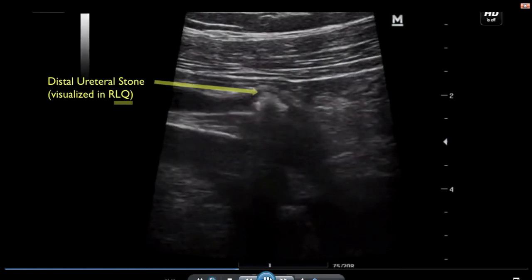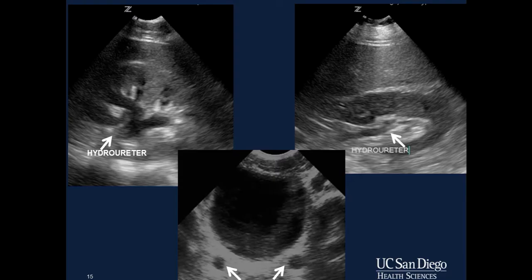Do you remember the kidney stone that we saw earlier in the lecture? It has since moved into the ureter and is likely causing the patient a fair amount of pain. Recall, one of the limitations of renal ultrasound is that the mid to distal ureter is generally obscured by bowel gas, making them difficult to see.